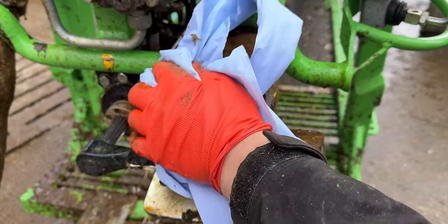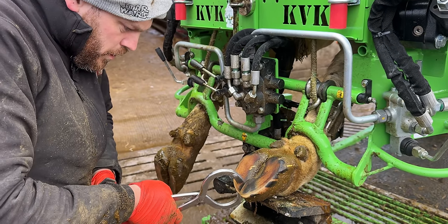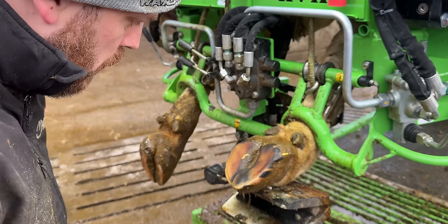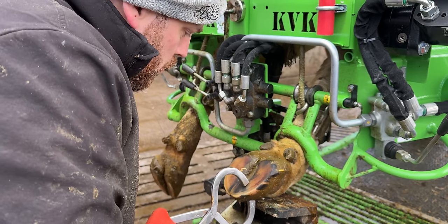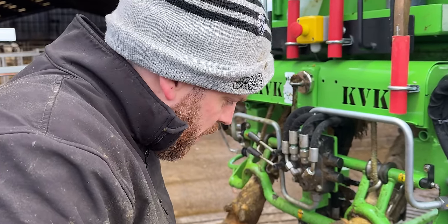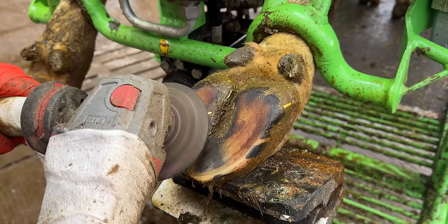Once it's clean I pull out the Hoof Testers. They are able to exert a huge amount of pressure to a very small area and I'm looking for a reaction in the cow to give me a clue as to where the problem is. You see her reacting there. As I press really hard on these, she's reacting, letting me know there's definitely something wrong with this outer claw.